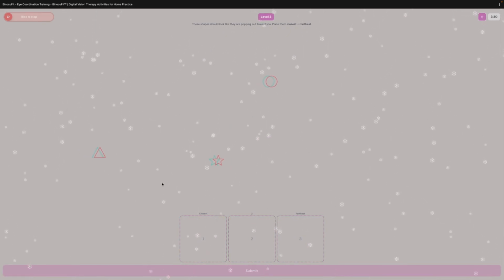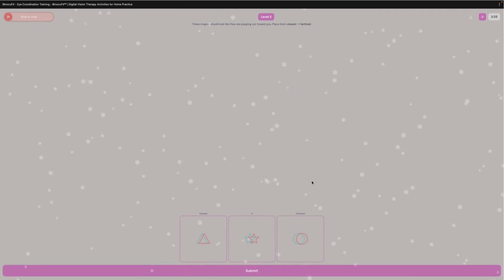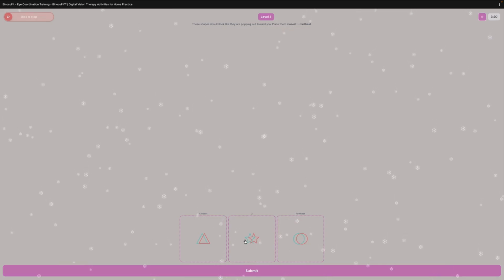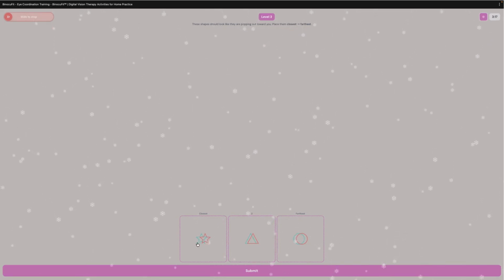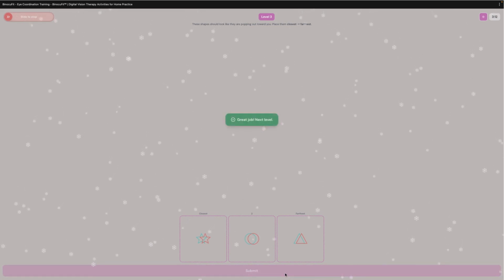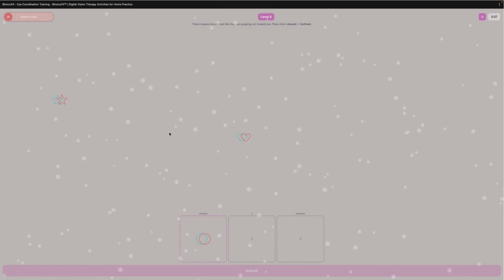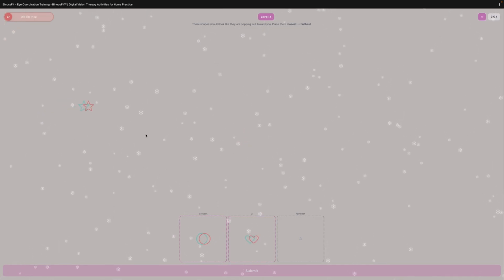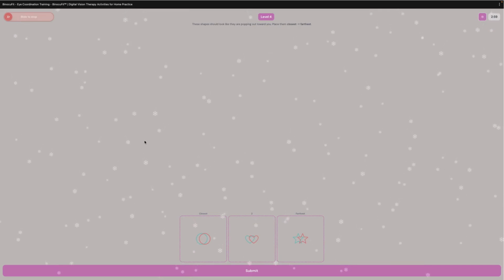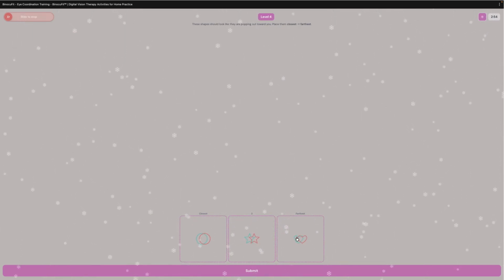So always remember that in that top right hand corner, we can adjust that snow. We can turn it on and off, and we can also change the transparency and the density of the snow. The snow really helps to give a reference for making those depth judgments, and also just make sure that we're not going into a tunnel vision type of processing where we have more openness in our periphery, where we have that stimulation there. So once we get the shapes down into the bottom, you can see that they're not quite right probably. So we can adjust them once they're down in the bottom.